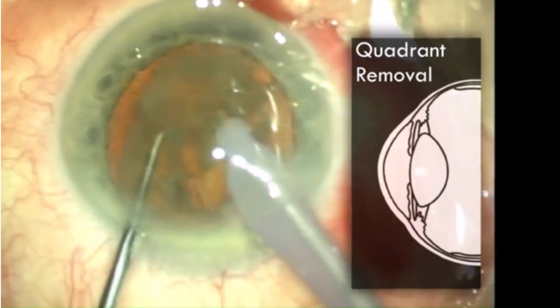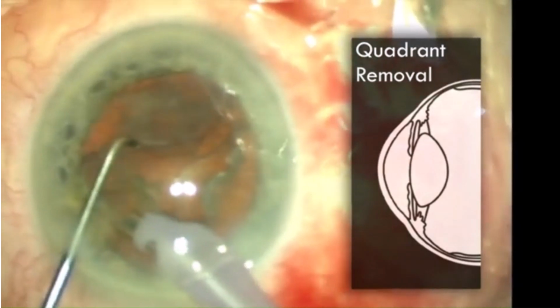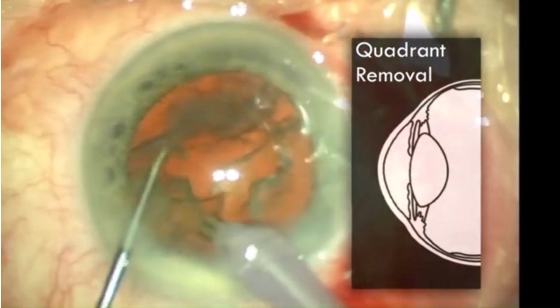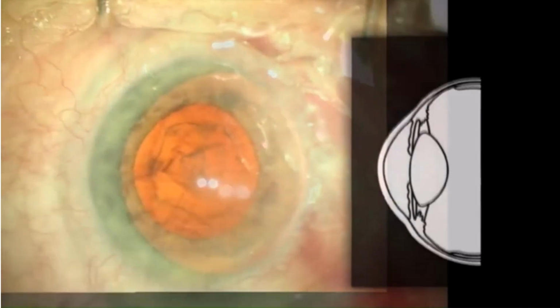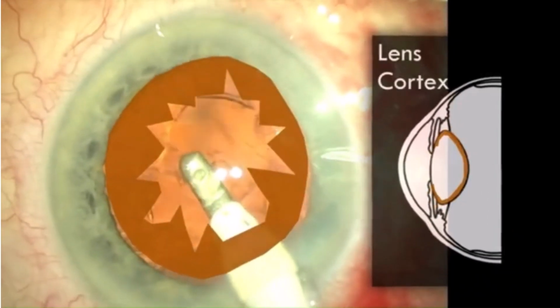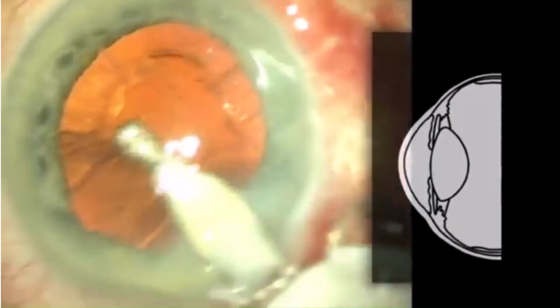So you see, the nucleus has been divided into four parts, four small parts, and each of the four quadrants is removed easily by the machine. On the left side is a manipulator or a dialer, which helps to move the nucleus with one hand. That's the cortex being removed.